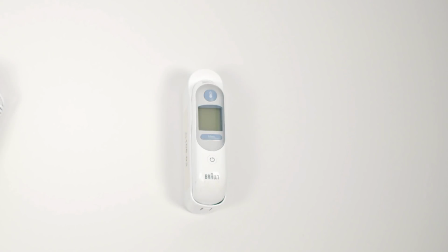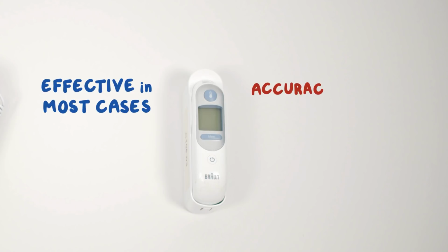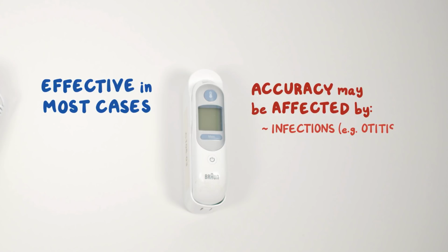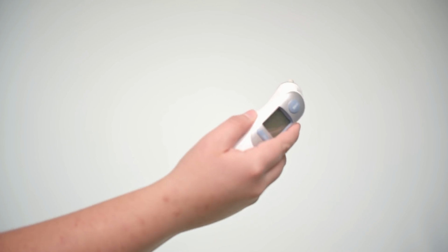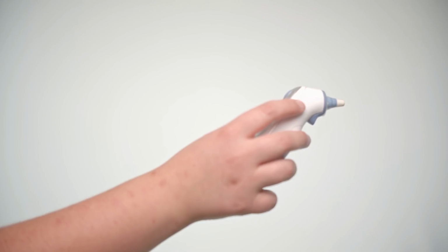Tympanic membrane temperature procedure. The tympanic membrane thermometer, or TMT, measures infrared emissions from Fred's eardrum. It's effective in most cases, but accuracy may be affected by infections like otitis media or just cerumen. Slide a disposable cover over the temperature probe. Now hold the thermometer with your dominant hand. If that's the right hand, place the probe tip in Fred's left ear canal, pulling the pinna back and up. If you're left-handed, use the right ear canal.